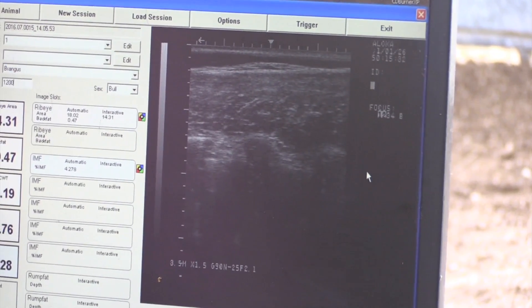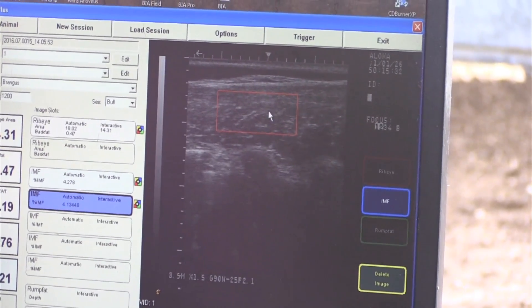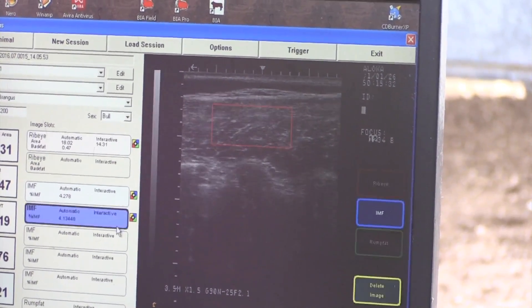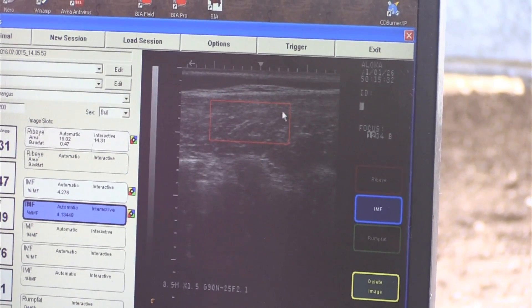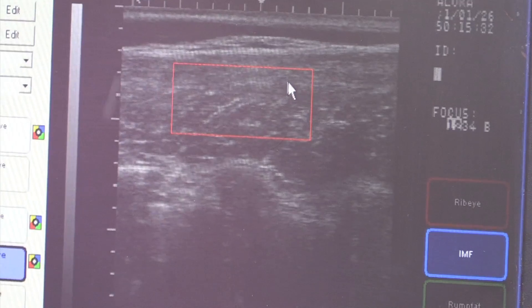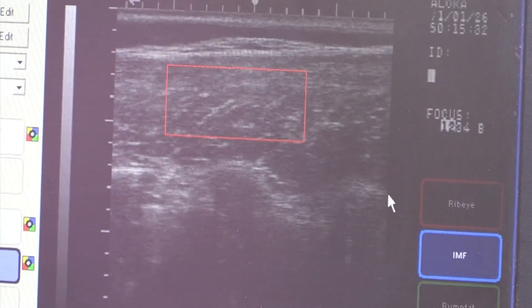We're going over here now to our software reading. I've already triggered it. This box comes up and what it's going to do is measure everything — the white. The whiter this image is, the higher they marble. Conversely, if this animal didn't have a lot of marbling, this image would be real dark.